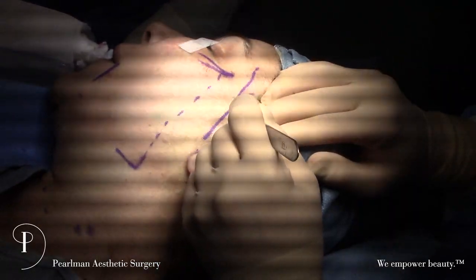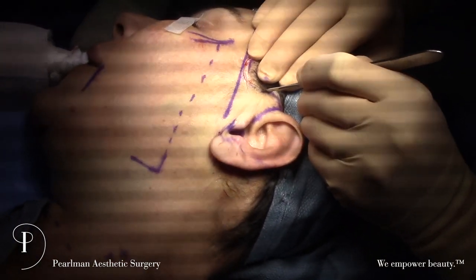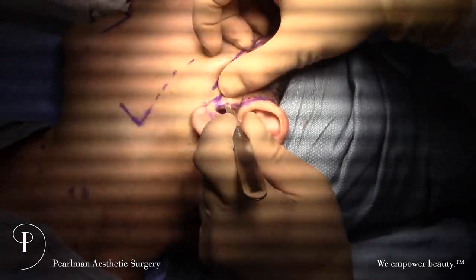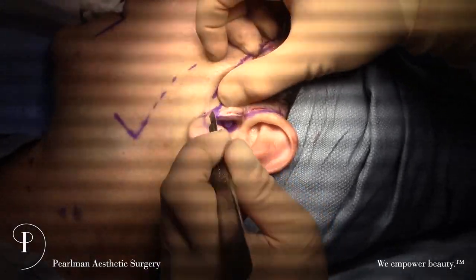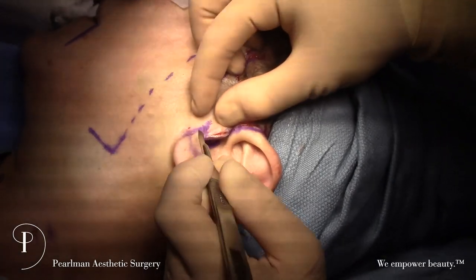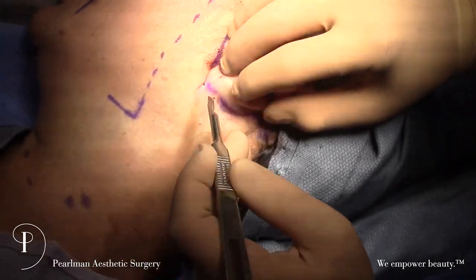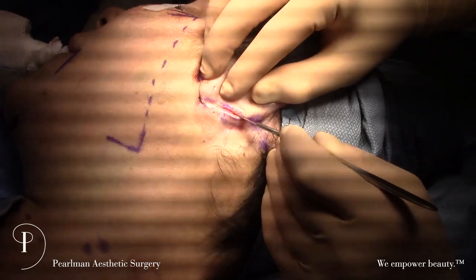Right at the edge of the hairline, even catching a couple of hairs — so when the hairs grow back, we have some follicles that are buried and grow through the incision, making a nice camouflage. Then curving down in front of the ear on the back edge of the tragus, which hides the incision very nicely within the ear. And then that little L-shape down here prevents getting a pleat in front of the earlobe. Then we come up on the back of the ear and stop about here.